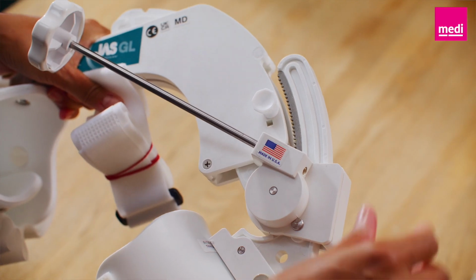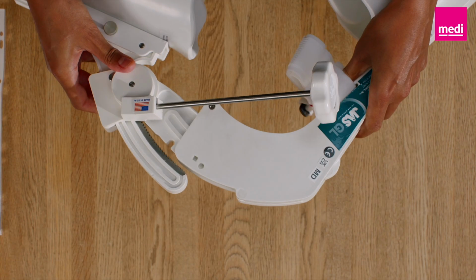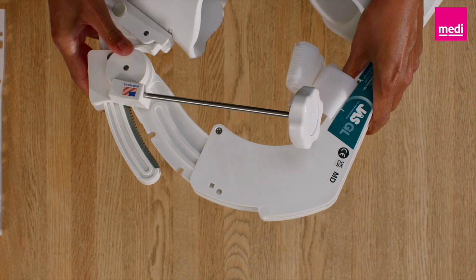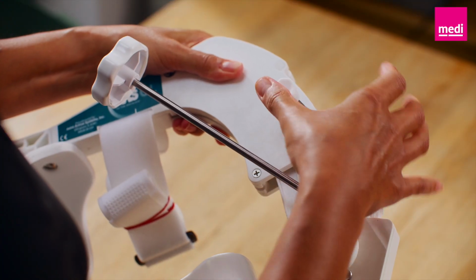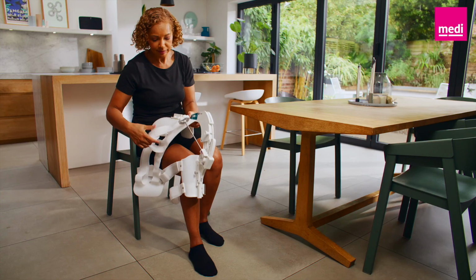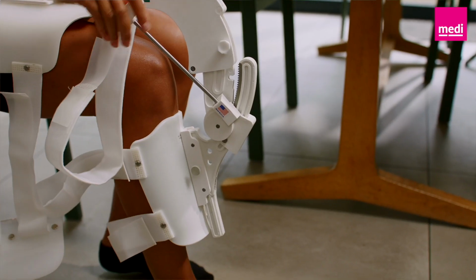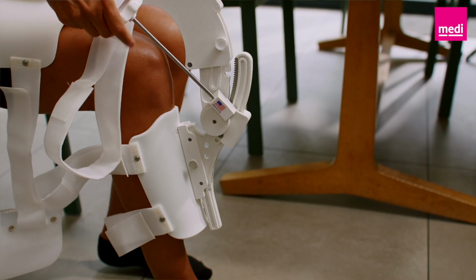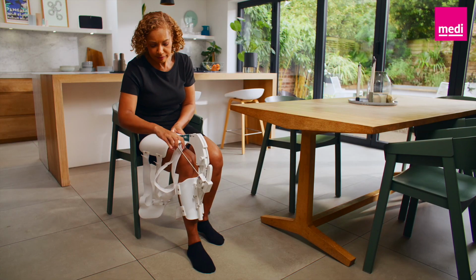To adjust the brace, first remove the pull pin. While holding the brace with both hands, slide the shin assembly through the groove as needed. Finally, place the pull pin in the setting that matches your range for bending the knee. To check if you have the correct pin setting, place the brace on your leg and make sure the angle matches the furthest you can bend your knee. Turn the therapy knob until the shin cuff rests against your lower leg.